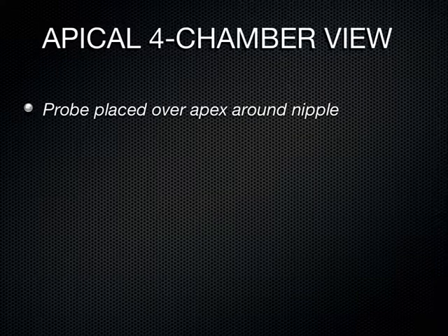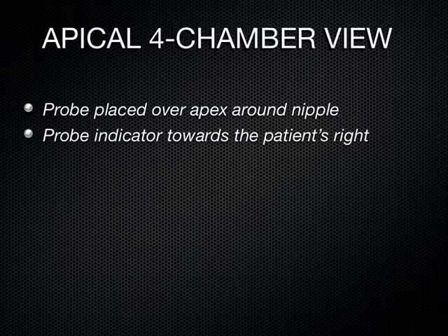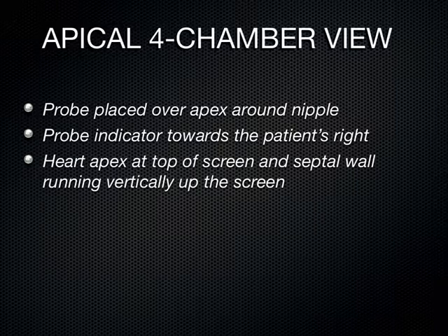This is probably the hardest view of the heart to get, the most challenging, requiring a lot of patient positioning. It's particularly difficult in women with large breasts because you have to move the breast out of the way to get to this little view here. So this is one you're going to struggle to obtain, but it's the one that gives you the most bang for your buck. You're going to place the transducer just inferior to the nipple line and lateral, down there by the nipple. And you're going to have the indicator to the patient's right.